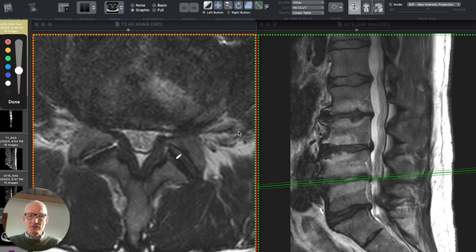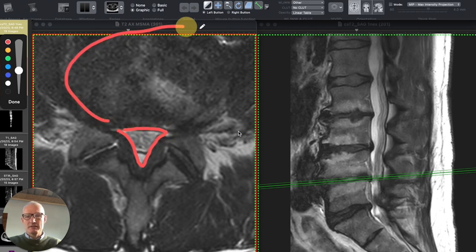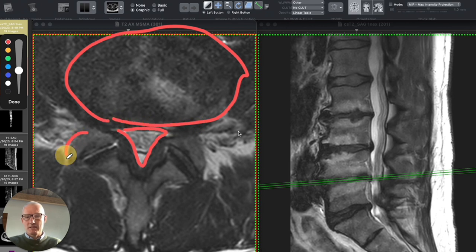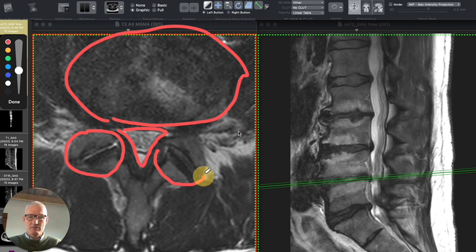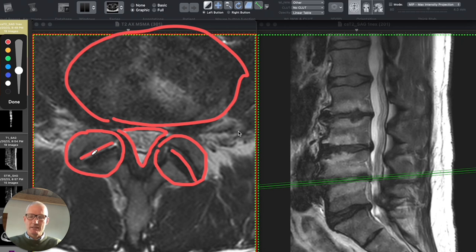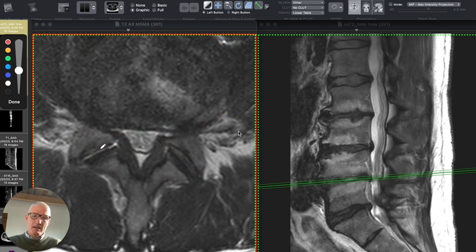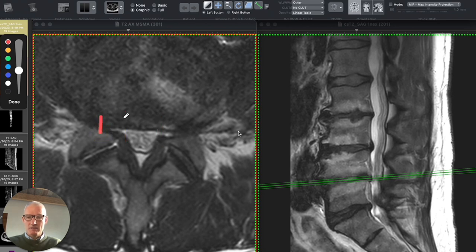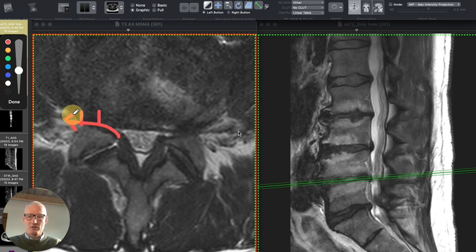The best way to appreciate the degree of stenosis on this scan is on the cross section. Here in cross section, this is the spinal canal at the L4-5 level. This is the intervertebral disc here. And then this is the facet joint on either side of the spine — that's the left facet joint, this is the right facet joint. You can actually see the articular surface of the facet and appreciate that on the right side there's a little bit of fluid inside the facet. The axial image is divided into three different sections: the central region of the spinal canal, the subarticular zone — so-called because it's beneath the articulation of the facet joint — and finally the foraminal zone, where the nerve root is going out through a passageway called the neuroforamen.